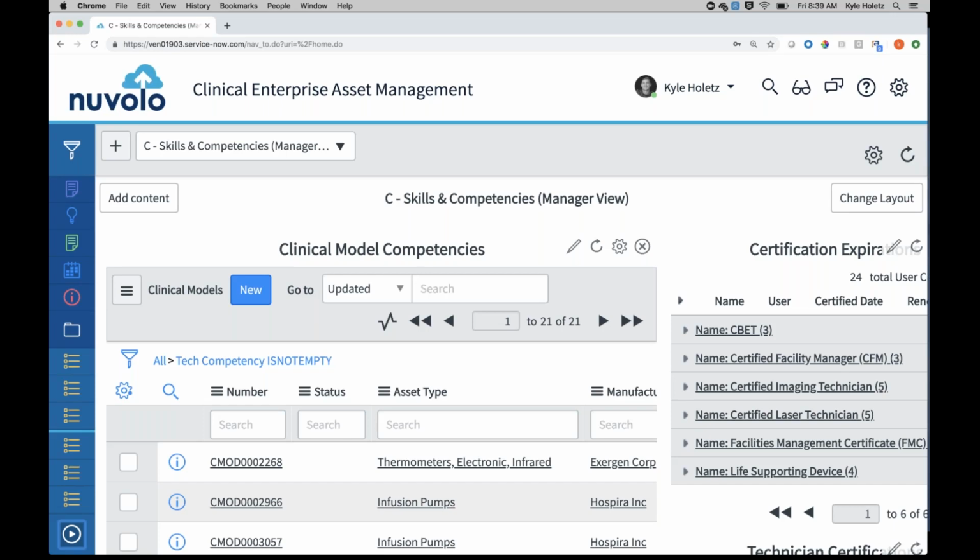We're trying to track uptime, which is almost impossible. That's why I like to see the CMMS have your start time and finish time. Well, you could have closed the work order 3 days later, so it was really down 3 days. You have those time stamps on most work orders, but what should really be on there is an hour field for the downtime: how long was this unit out of service? And a lot of things really don't matter because they have backups. What matters is the stuff that's making revenue, which you have to have.